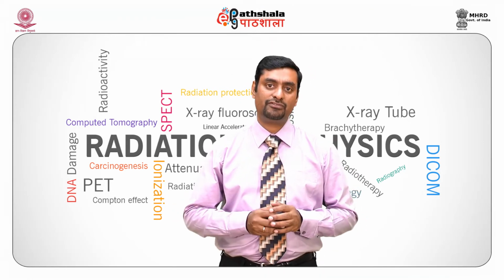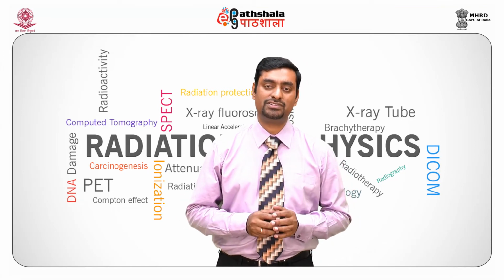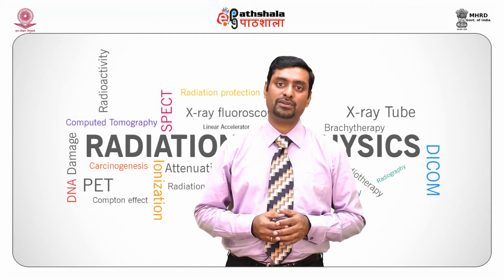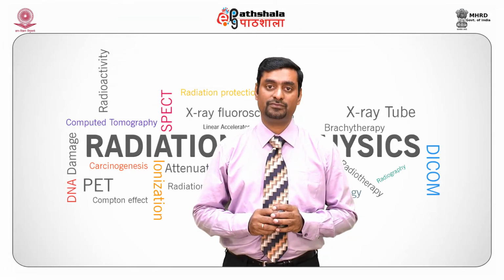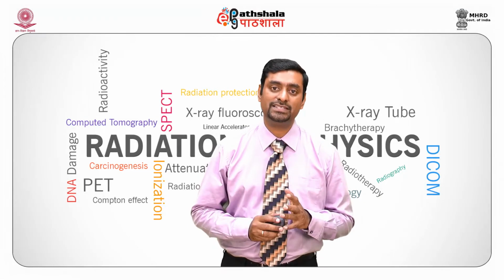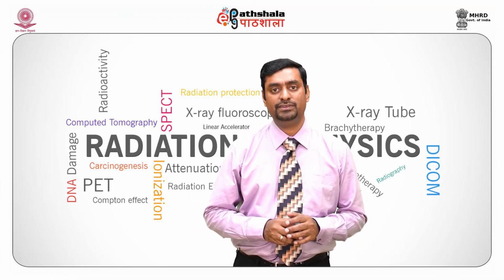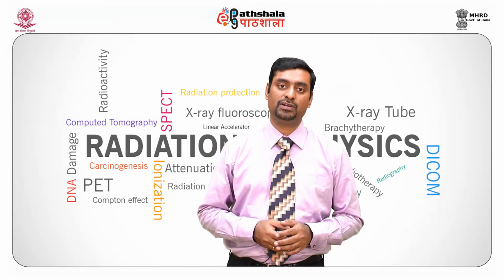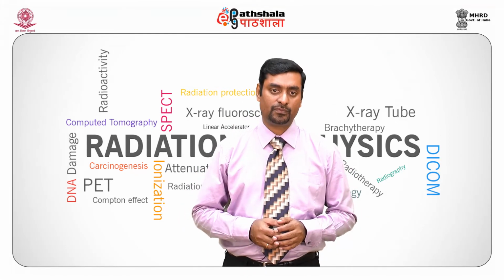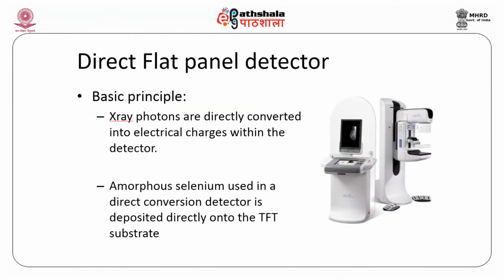But since we have reduced spatial resolution, or there is a loss because of this light conversion, we need a direct flat panel detector. We should behave like a film without a film screen, without an intensifying screen. So, what is there in the direct flat panel detector? This kind of detector is more commonly used these days, but it is more expensive compared to the indirect flat panel detectors. In this principle, X-ray photons are directly converted into electric charges within the detector.